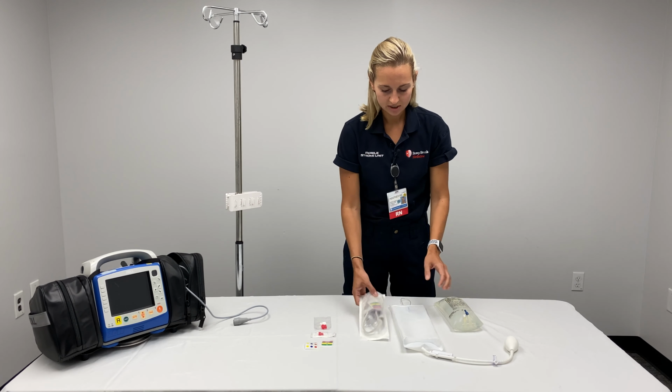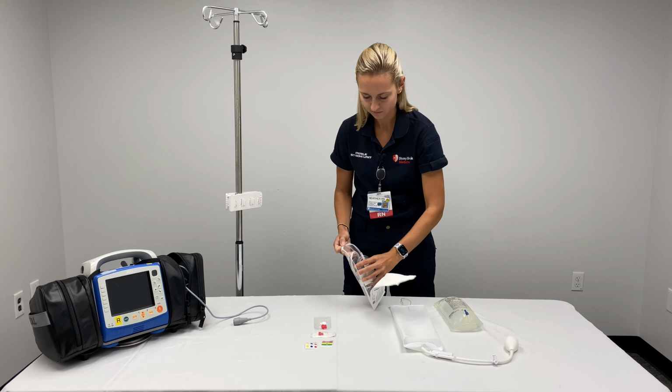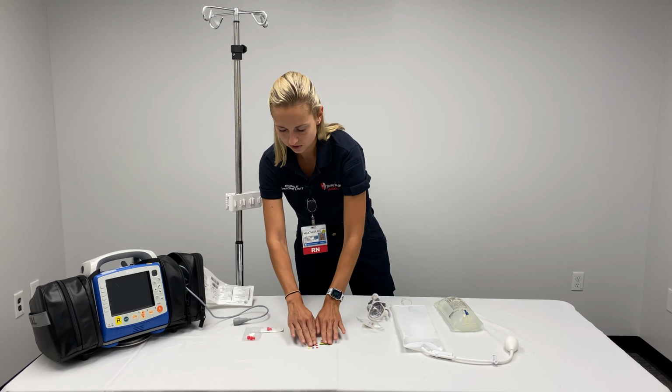So the first thing that you're going to do is open up your A-line setup. Make sure you don't discard the caps that come with the setup. These are just extras.